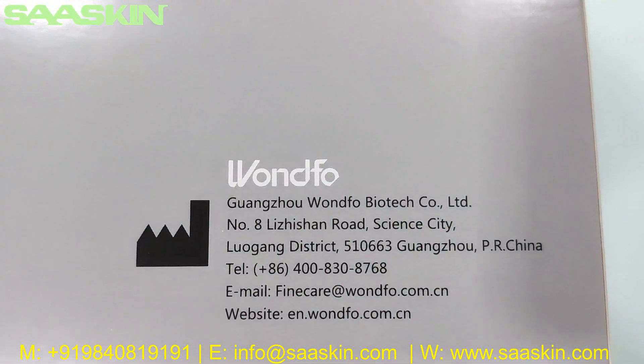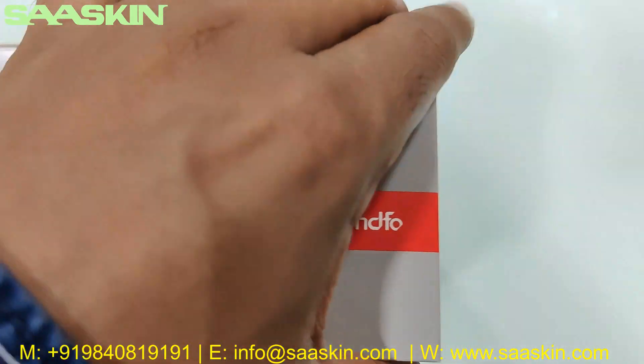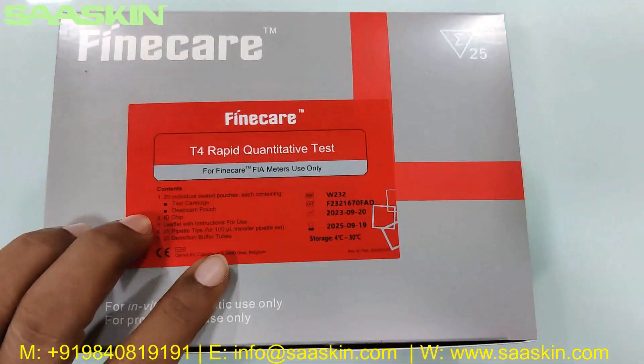You can see here the manufacturing address — the company is based in China. This is how the outer box looks like.